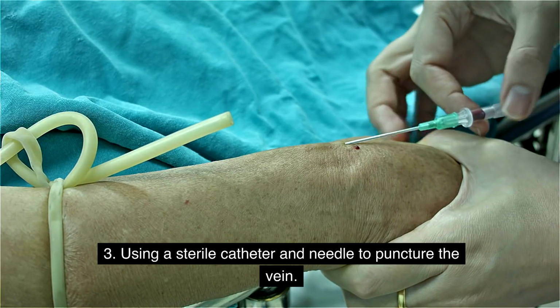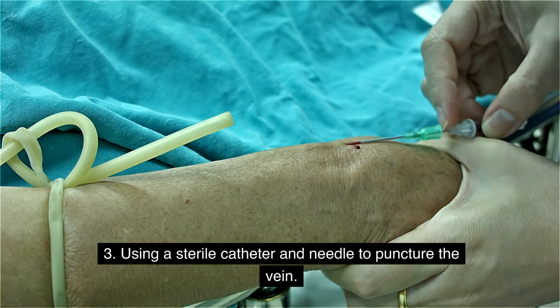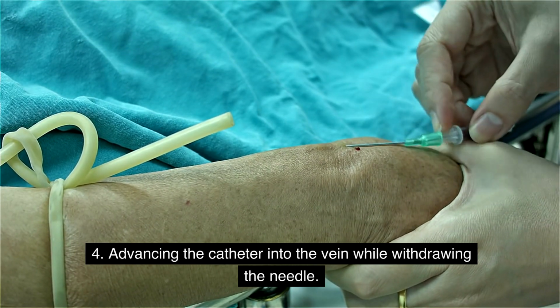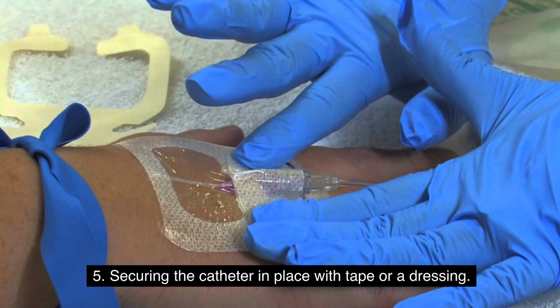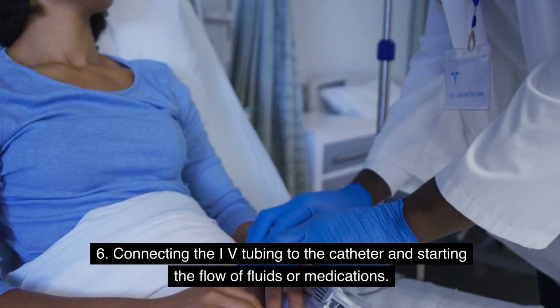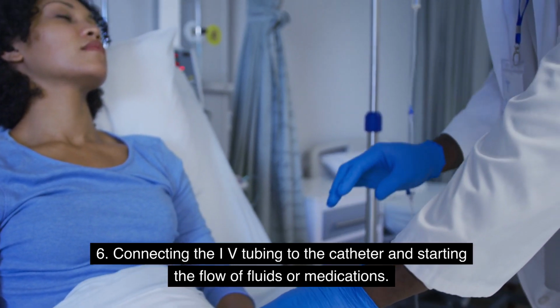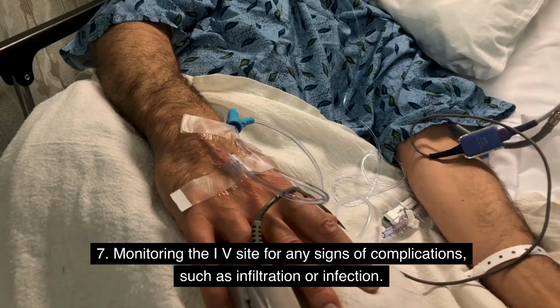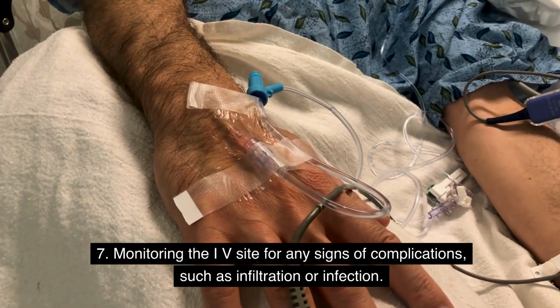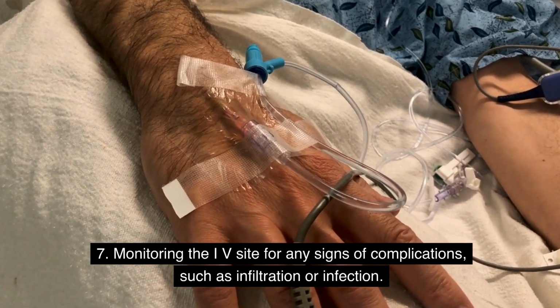3. Using a sterile catheter and needle to puncture the vein. 4. Advancing the catheter into the vein while withdrawing the needle. 5. Securing the catheter in place with tape or a dressing. 6. Connecting the IV tubing to the catheter and starting the flow of fluids or medications. 7. Monitoring the IV site for any signs of complications, such as infiltration or infection.